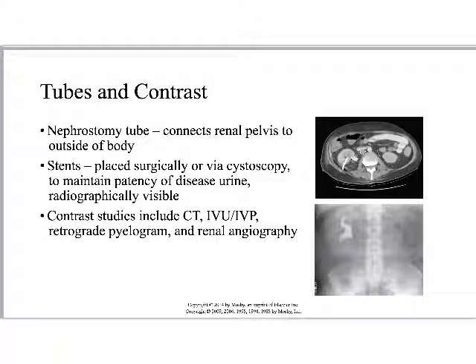Versus retrograde pyelogram. The patient doesn't even need an IV for this. I'm accessing the kidneys retrograde. We're going up through the urethra to the bladder, and we're either creating sufficient pressure in the bladder, if you can imagine that, with like half a liter of fluid, and forcing it back up the ureters due to the pressure, causing backflow into the ureters, or we're accessing through the bladder up into the ureter and then causing backflow in that direction.